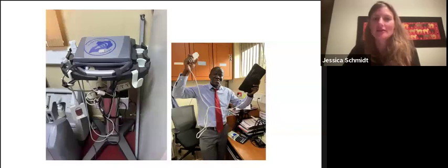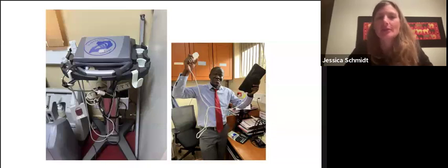We initially got the Sonosite M Turbo, which I'm sure many people have used, and we got that machine because there were advantages for the Doppler that we wanted to use for research and the different probe types. But we knew going into it that there wasn't actually a vendor in sub-Saharan Africa. And so when the machine breaks, it has to be sent with someone back to Europe with potentially a large servicing fee. And so we've also used these smaller tablet models, which are pretty convenient because they're lower in price point, and some of them have really good images.